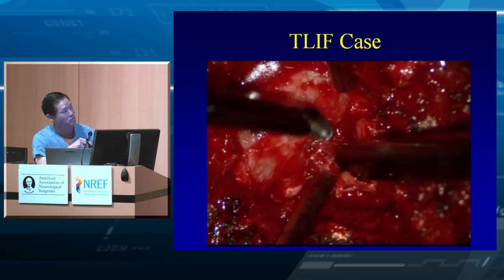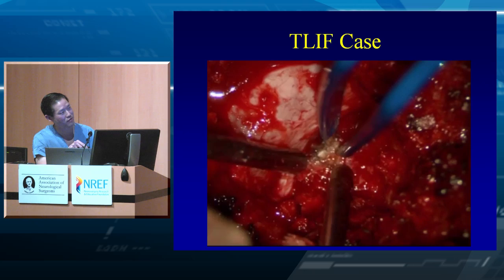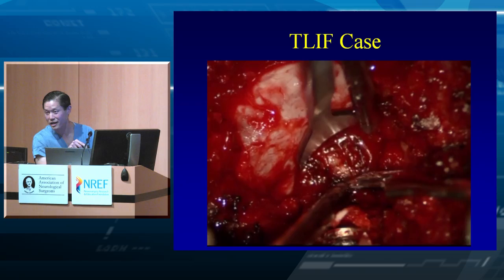So that's just ligamentum and laterally. But note, we're not going to have to retract at all. So here's a traversing nerve root right here, L5. There's a lateral edge of the thecal sac. Look how much room we have laterally. This is pretty standard for TLIF. L5-S1, it's even more capacious. We just put a nerve root retractor here just for protection, just in case we slip medially. But we're not retracting at all, right? So hardly any retraction is required here.